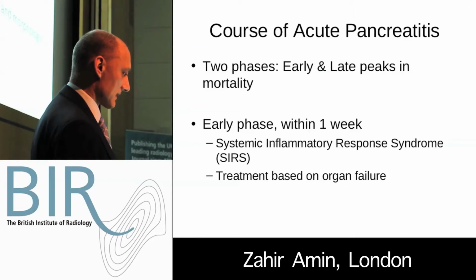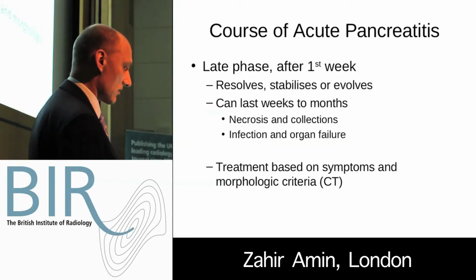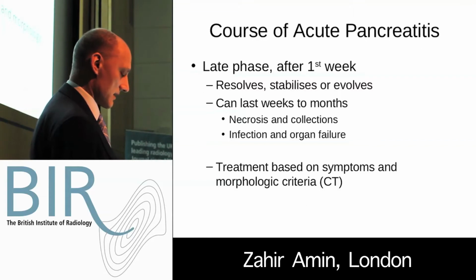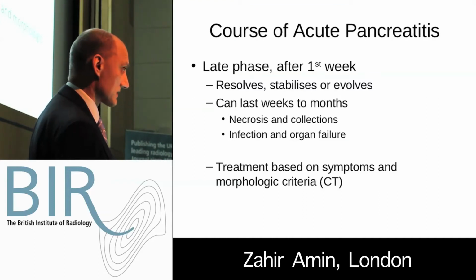The later phase is usually after the first week. The changes of pancreatitis may resolve, it may stabilize or worsen, and this phase can last from weeks to months, and is characterized by the presence of necrosis and pancreatic collections, complicated by infection and organ failure. And treatment of this phase is based on the symptoms of the patient and morphological criteria by CT.